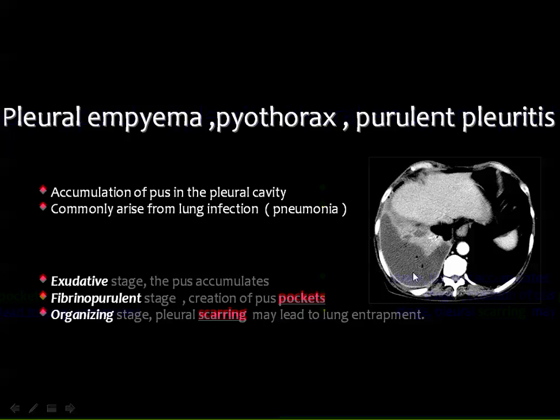If the patient had been subjected to interventional techniques, the air loculi may be secondary to previous intervention, but the air loculi which are highly suggestive of infection are usually present without a history of previous biopsies, for example, or aspiration, and so on.